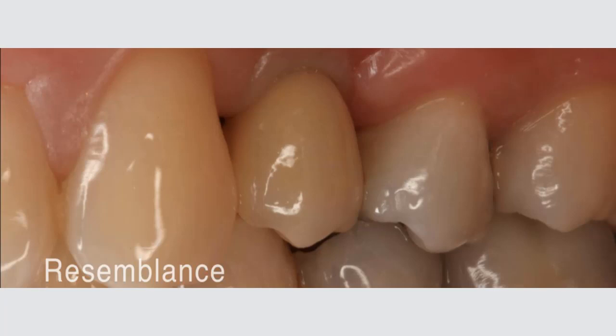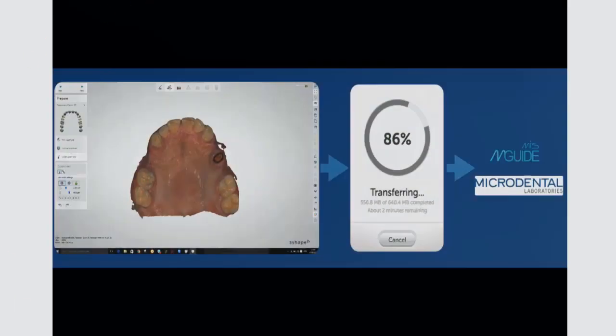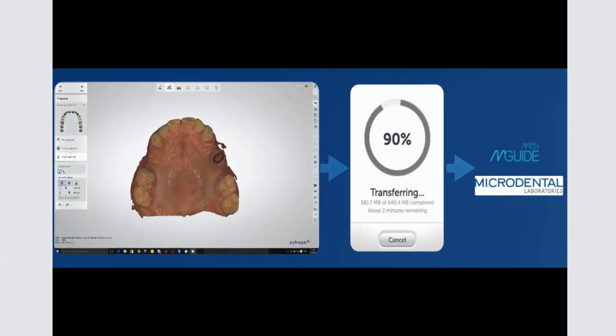Nice work done, very fast, and as you can see, the shape and the dimensions, of course, very much depend on the case, but you can be very successful using machines to provide a decent work for your patient. Here is just before and after. The shade was taken based on the canine, A3, and then we were able to match the A3 shade for the patient.